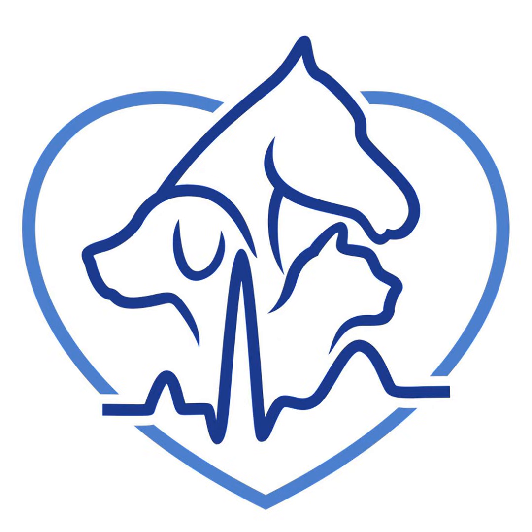So I don't know what that perfect setting is for everyone on all their transducers on every machine. I think you have to play around with that a little bit, but you're going to have to go with a slightly lower frequency than what you're used to when measuring just your 2D image in order to keep those bubbles around. Jose, you've been using it a little bit. Do you agree with that?